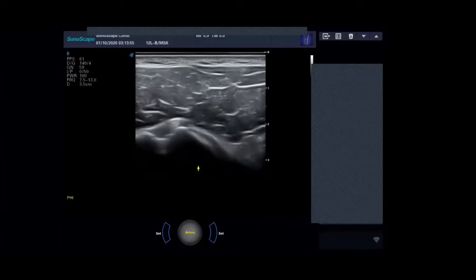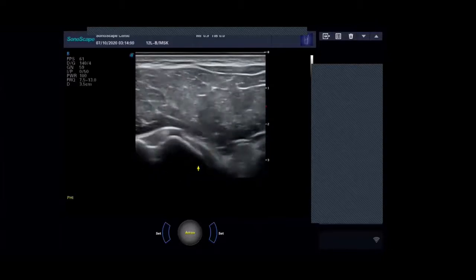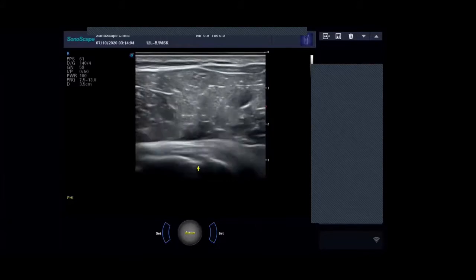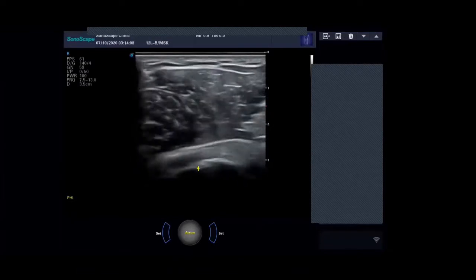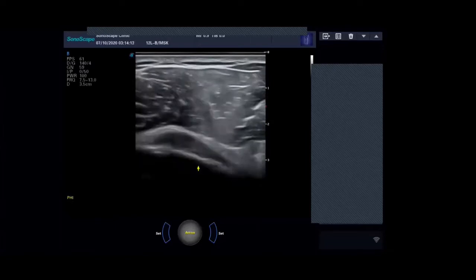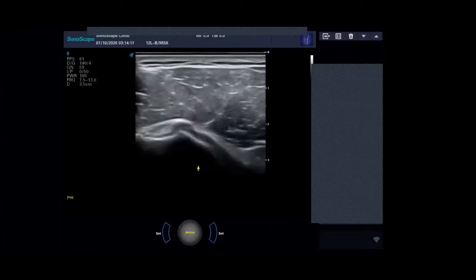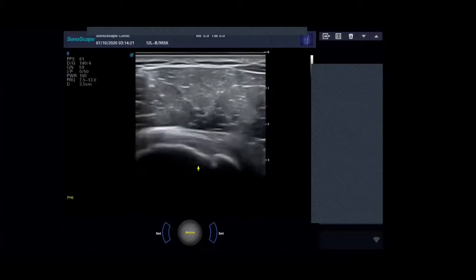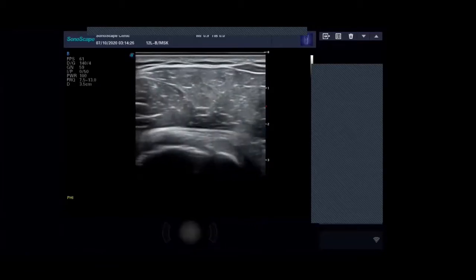So this is good. This is good actually while we're here. So you can test the medial subluxation here. So there it is sitting in the groove, and you just rotate out, and it's fine. It's not coming out. It's staying within the groove. Okay, that's subscapularis there, by the way. So that's looking for subluxation of the biceps tendon. If it does sublux, it will tend to sublux anterior to the arrow.